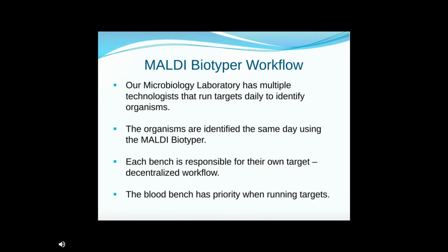So I'm going to go over a little bit of the MALDI Biotyper workflow. So we have multiple technologists that work in the laboratory, and everybody is on their own benches, so everybody has their own target that they spot, and each bench is responsible for identifying the organisms that are on the plates that are in front of them.